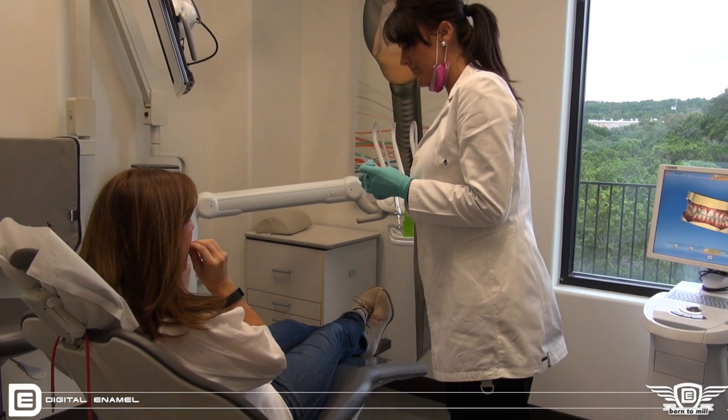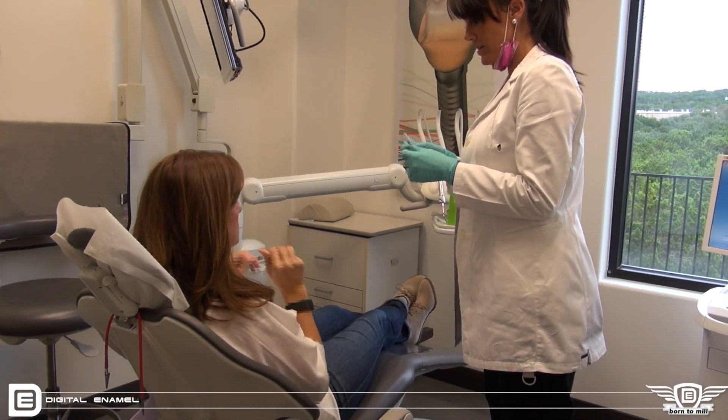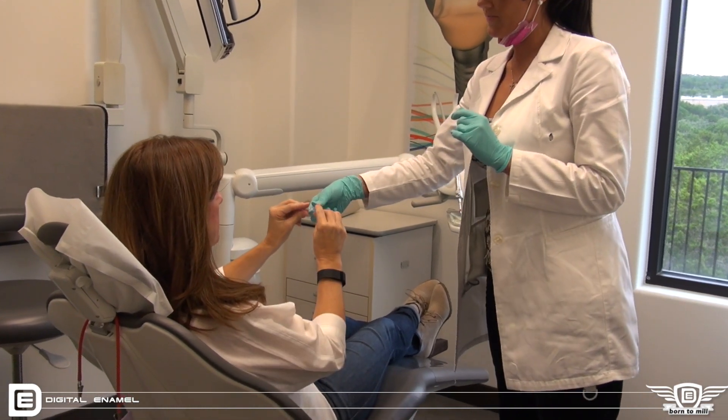What I love about this whole process is that there's very little downtime. When the patient comes in and wants to have the treatment, all it takes is a quick scan. You send it to ClearCorrect, they'll analyze the case for free and give you an idea on treatment time and how many aligners. You order it and then all it takes is delivering the aligners.